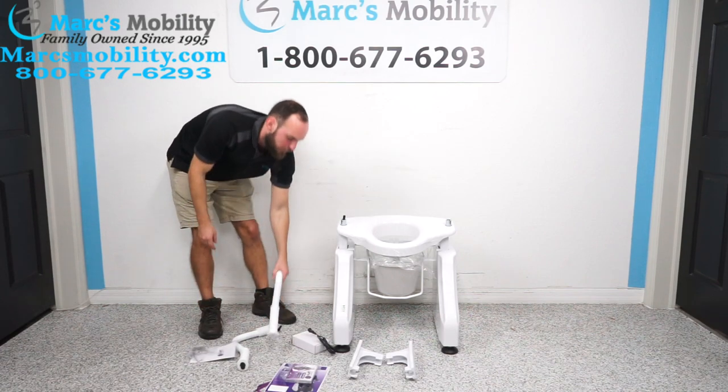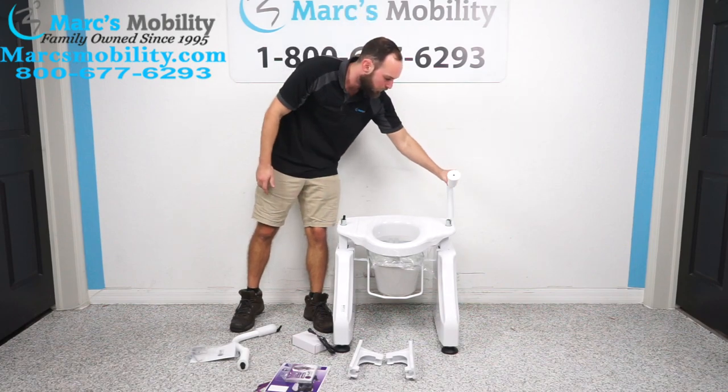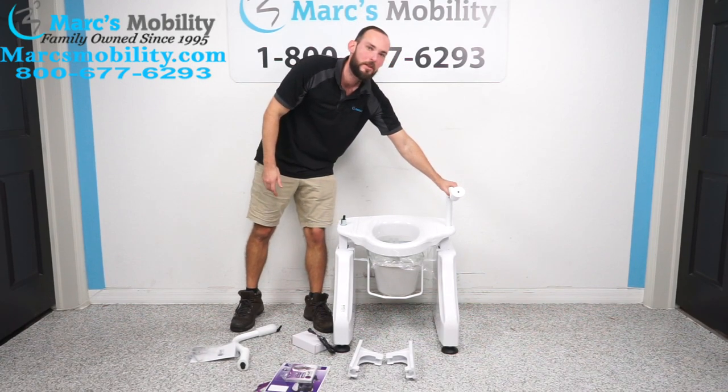To start, I'm going to start with the arms. I'm going to take the left arm — this is the one without the switch — and it just falls into this post, just like that.